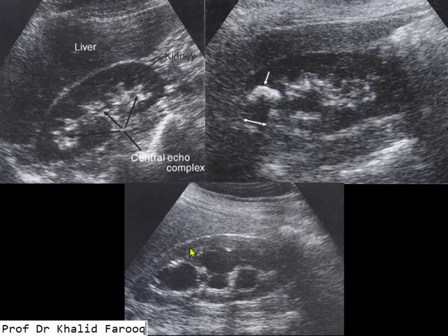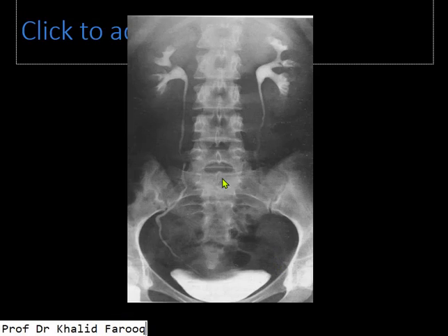in the right kidney. We can also see thickness of the surrounding renal parenchyma, and we need to measure in upper, mid and lower pole for the assessment of renal parenchymal thickness in those cases who present with mild, moderate or severe hydronephrosis. Here we have IVU examination.